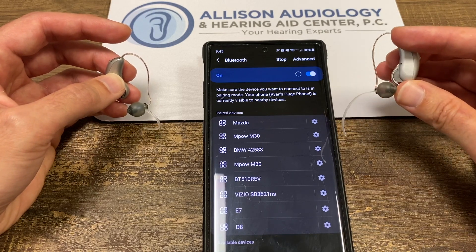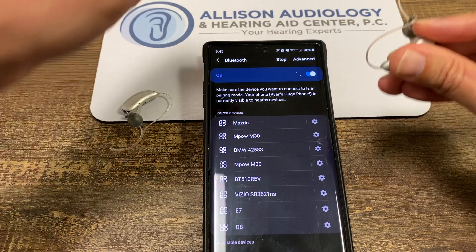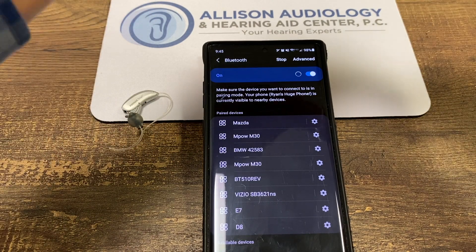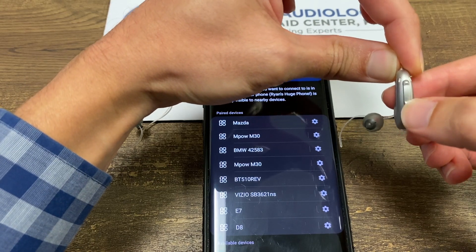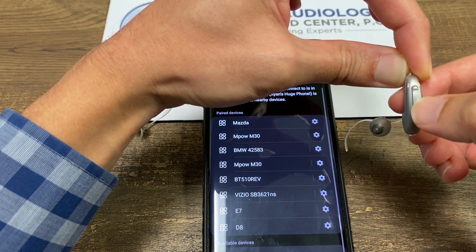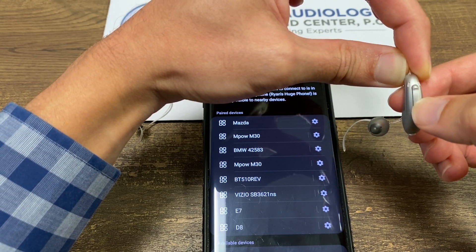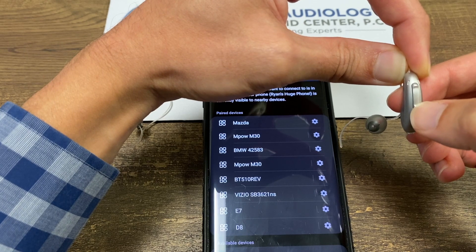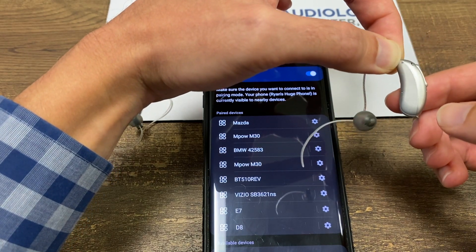For the right one, you can either open and close the battery door. Or if you have the rechargeable ones, you can hold the bottom button for about five seconds — you'd see a little red dot indicating it's off — and then hold it again for five seconds. It'll turn green. That's for the rechargeable ones.